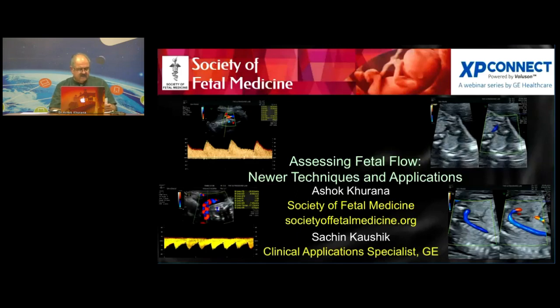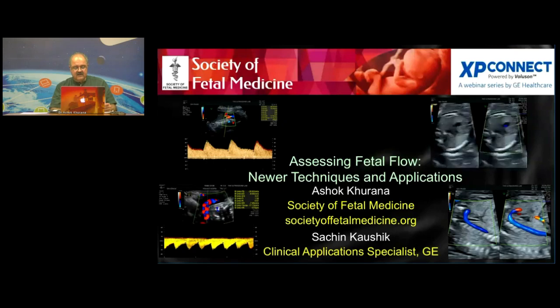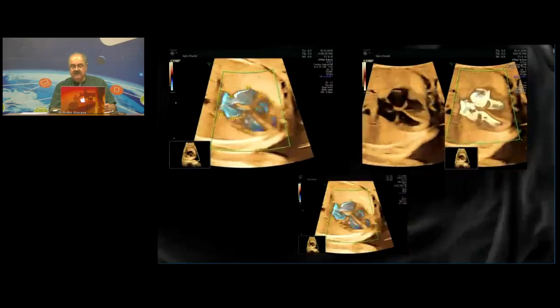Does the biophysical profile have any relevance now? Not for decision-making for growth restriction, but it definitely does in a scenario of decreased fetal movements in the third trimester because of chorioamnionitis or a cord event such as a knot in the cord. In that situation, we absolutely have to be sensible enough to realize that we must use a biophysical profile, because then there is nothing wrong with the Doppler, there is something wrong with the fetal environment.